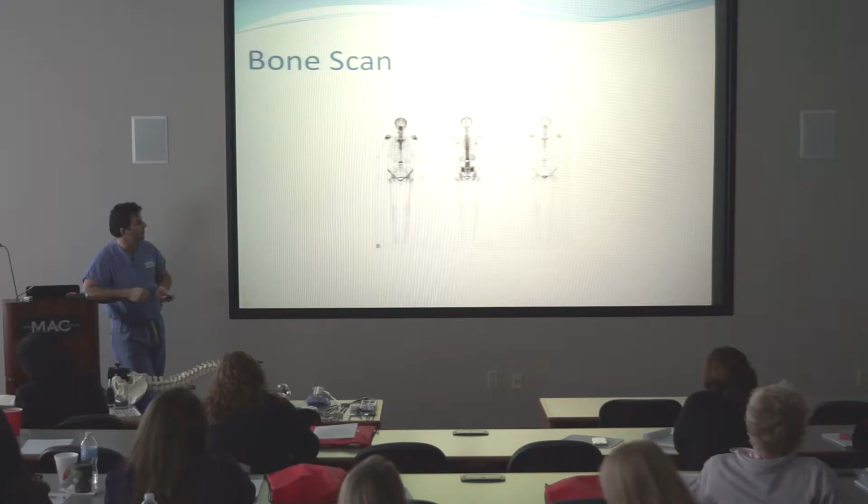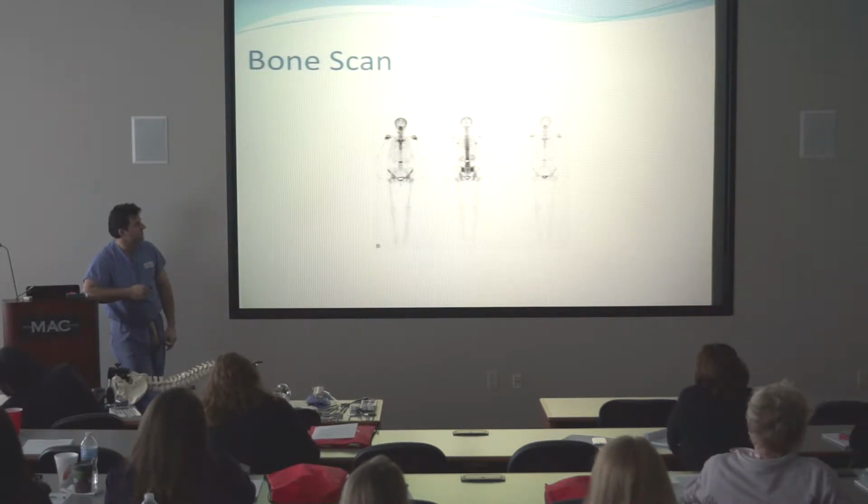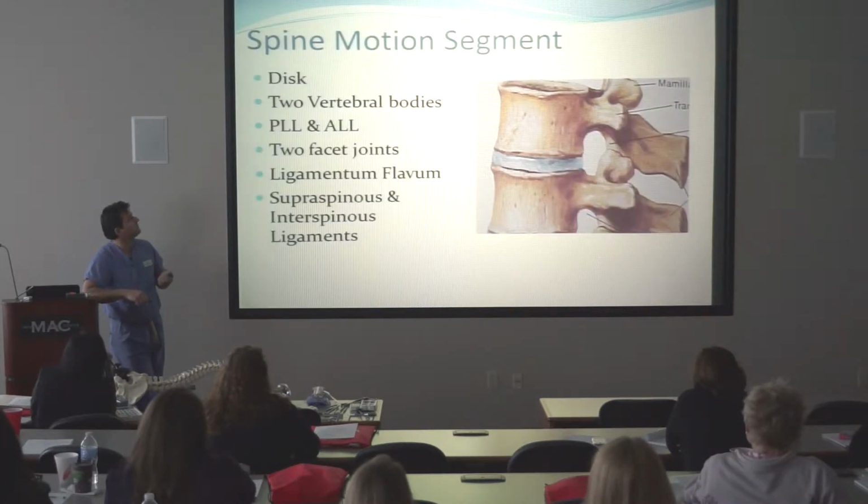So we'll get a bone scan to look for any increased activity in the body. What that entails is basically injecting a radioactive dye into the body. The bone cells, the ones that produce and make bone, preferentially drink up that dye, and then you run a sensor over, kind of like a Geiger counter, to pick up the activity and see where it is. It shows you that there's an issue right there in the lumbar spine. This is sort of an inverted picture, and here too. But that's a bone scan. We don't use them a whole heck of a lot anymore.